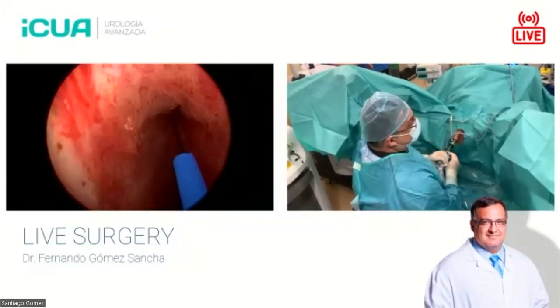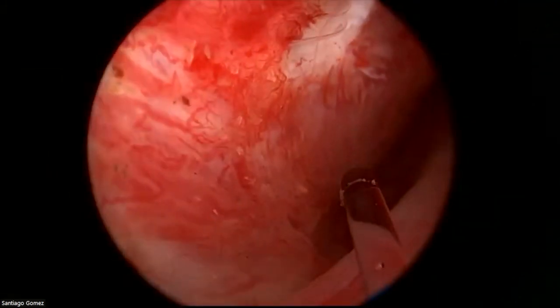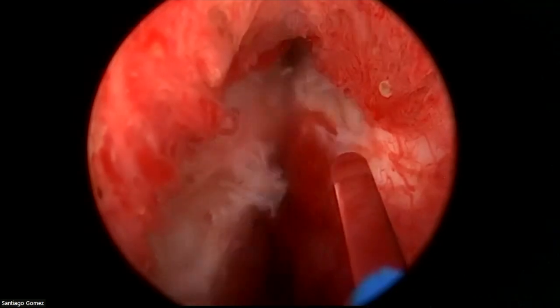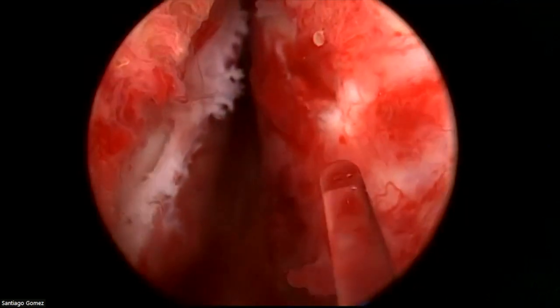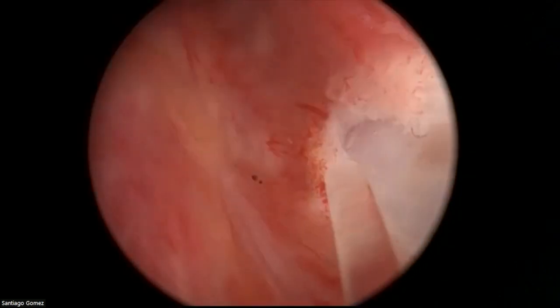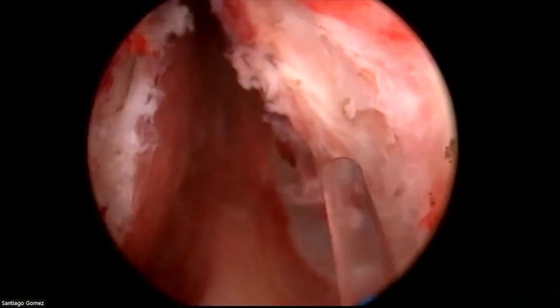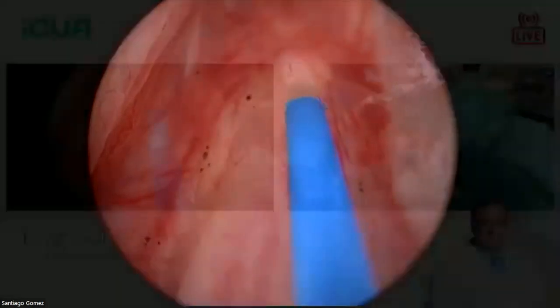So I will start by marking this line with the laser. The patient is coughing a little bit. These are movements from the patient. We are doing a spinal anesthesia. So sometimes we have this lack of collaboration with the patients. But here I'm marking the white line. You see, it's trying to determine where's the limit between the sphincter and the apex of the prostate. Sometimes this comes very much below the veromontanum.